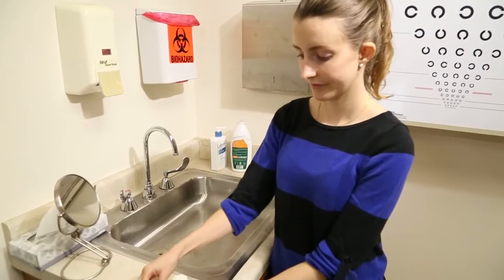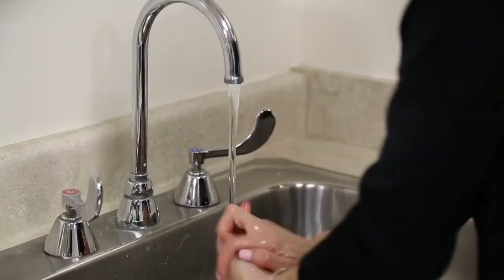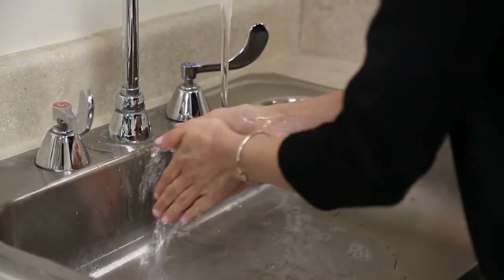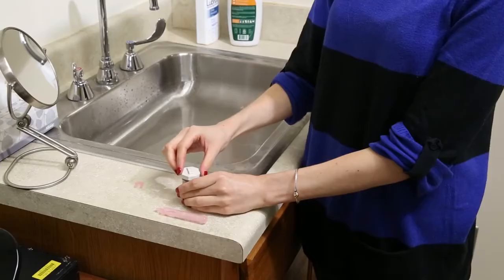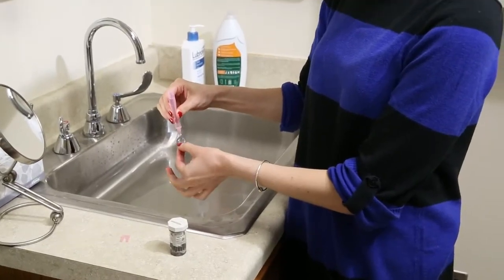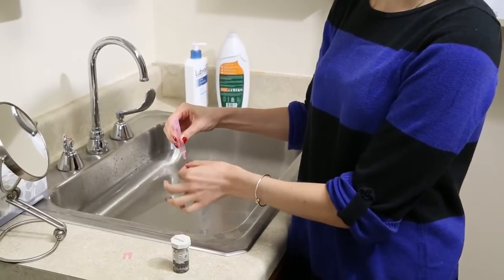For insertion of the lenses, prepare your area, wash your hands and dry them thoroughly, and place a fixation target in your line of sight. Remove the lens from the case and make sure the lens is cleaned and rinsed with saline solution.